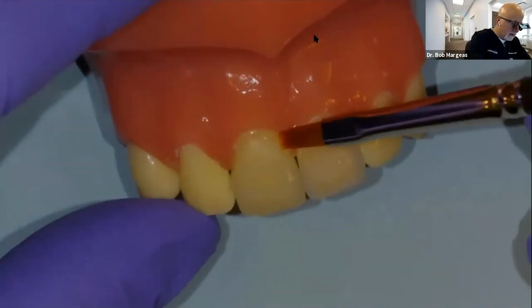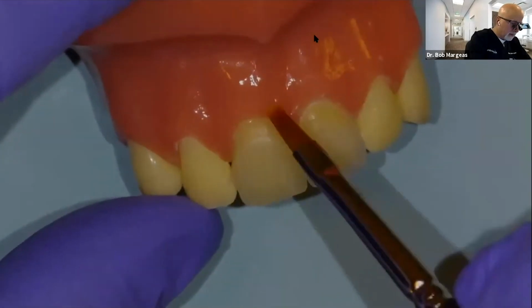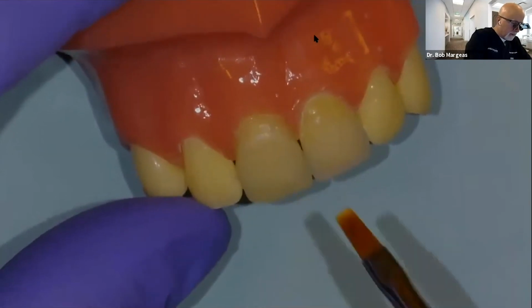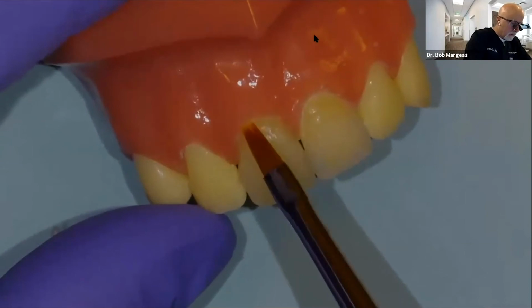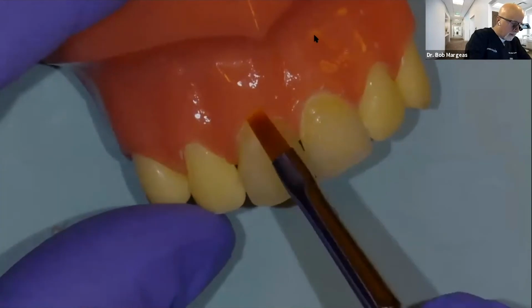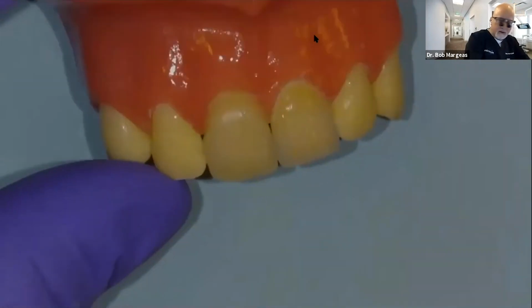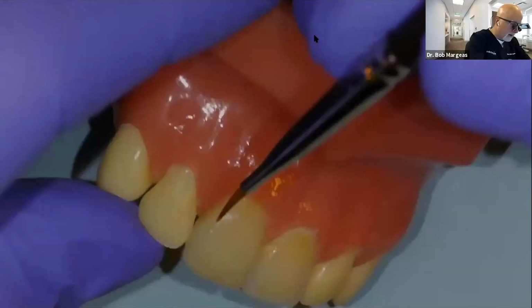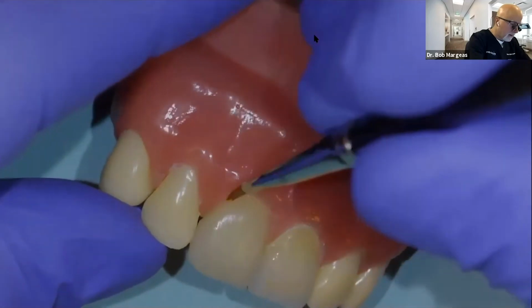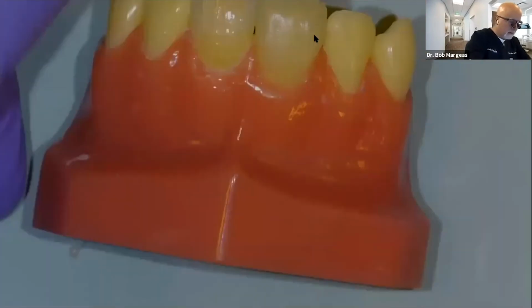So as I'm doing this, if I was doing this on a patient, it's exactly the way I do it. I use my brushes, blend the material. And I want to make sure that I don't have any white lines, or no lines that I can't finish really well. So I'm going to cleave this off the edge.